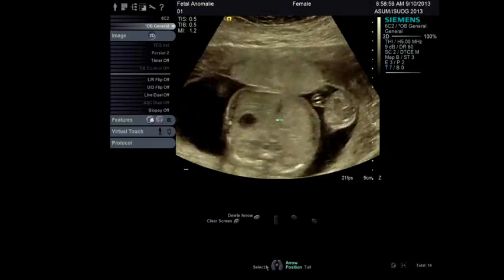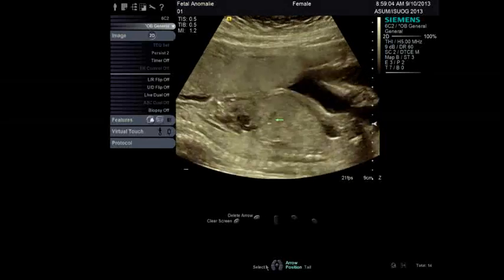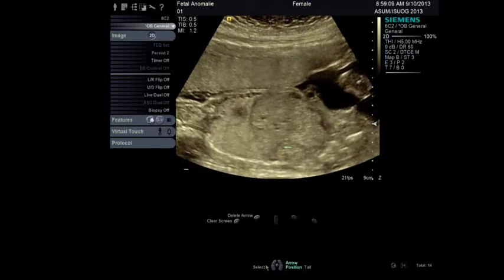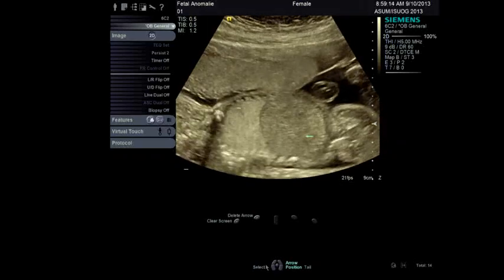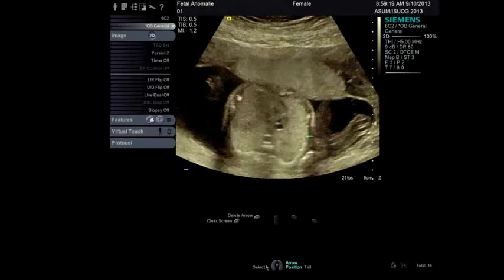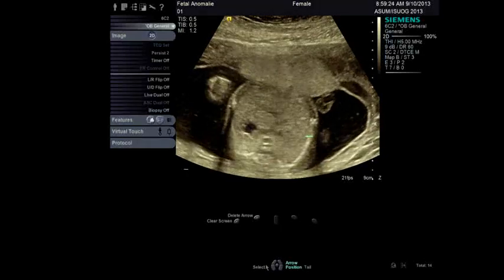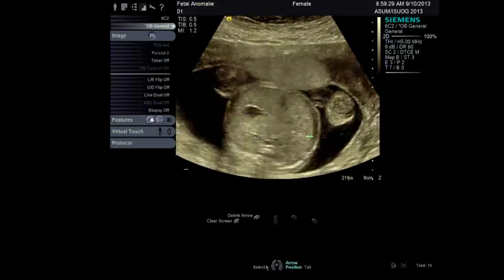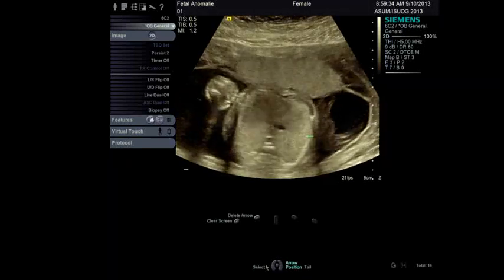but more when you come to the sagittal view, so seeing the inferior margin of the liver, we found not to be a very reproducible measure. You can kind of see it there. But as you move into the third trimester, it often becomes quite difficult. You've got to remember that the abdominal circumference is mostly consistent of liver. And if you compare the studies that have looked at liver size to abdominal circumference, there's quite a close concordance between AC and liver size. So I don't know if by trying to measure the liver itself, we're making our life a little bit unnecessarily complicated.